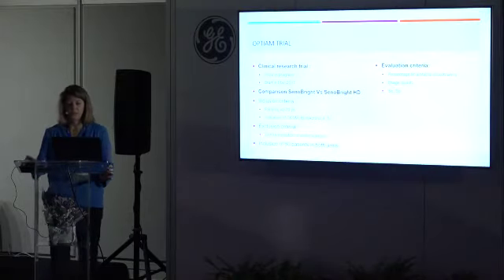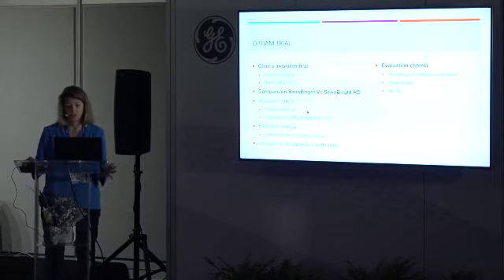So this trial started in May, and we haven't finished yet. We will finish in a few weeks. We include patients from 40 to 70 years. We exclude BRCA1 and BRCA2 women, and we include patients who will need a contrast mammography, especially BI-RADS 0, 4, and 5. And of course, we exclude patients with contraindication to iodine injection, and we include patients in both arms, randomly selected, 50 patients in both arms. And we will evaluate percentage of artifact, image quality, sensitivity, specificity.